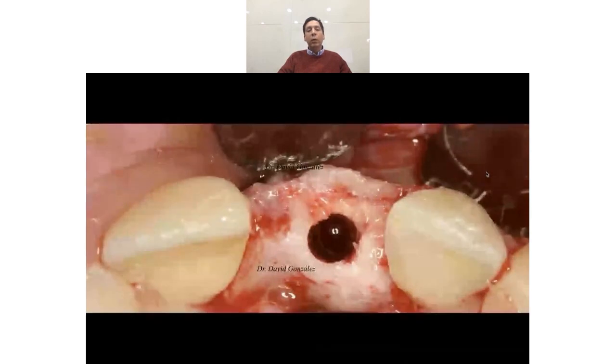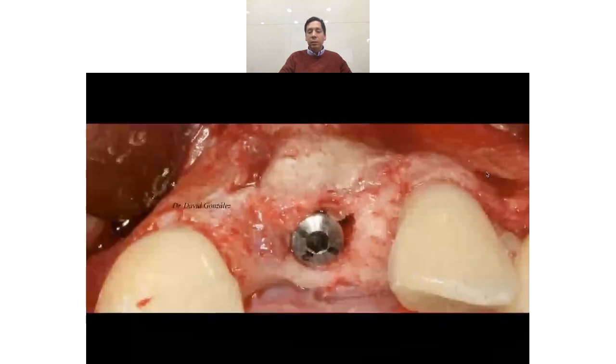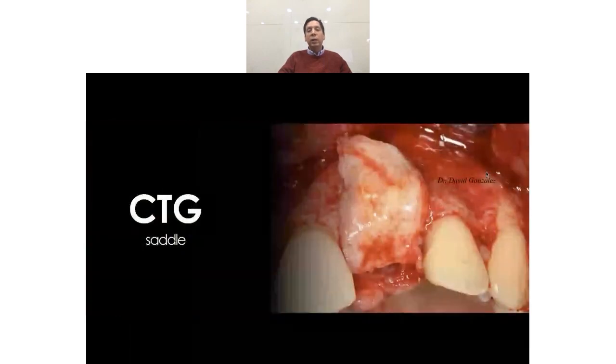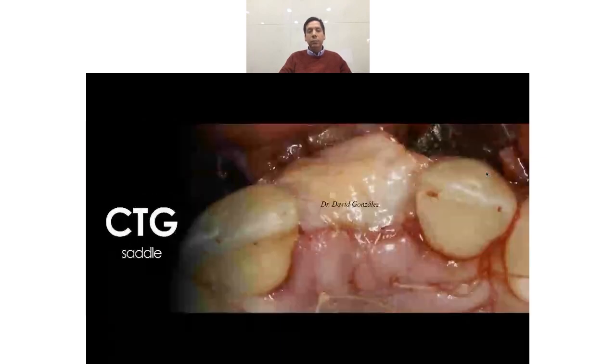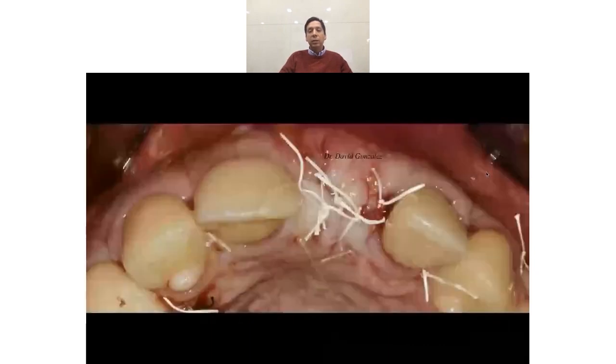So we were able to place the implant. It's a 4 millimeters implant. We can see here the implant surrounded totally by bone. And as always, I placed a CTG as a saddle. We see the CTG. And we cover everything after releasing the incisions.